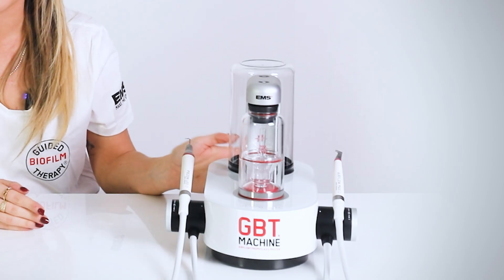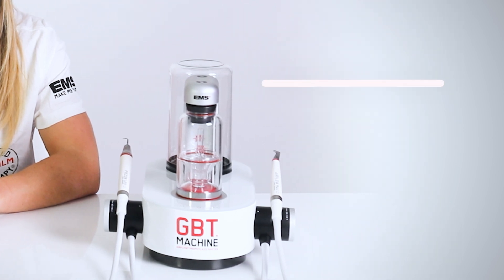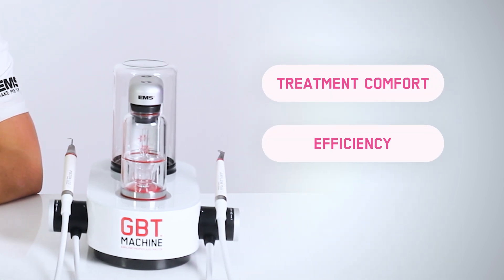The No Pain Max module is exclusive to our GBT machine and has been meticulously developed to enhance both treatment comfort and efficiency. Traditional scalers operate with a fixed power level throughout the procedure, regardless of the type or presence of calculus. This constant power delivery can lead to unnecessary invasiveness and discomfort for our patients, even when no calculus is detected.